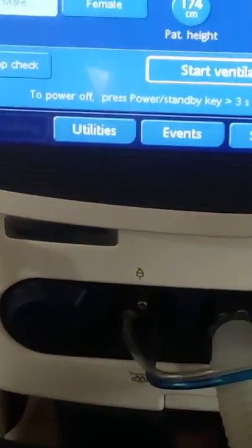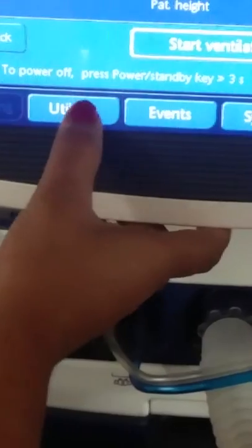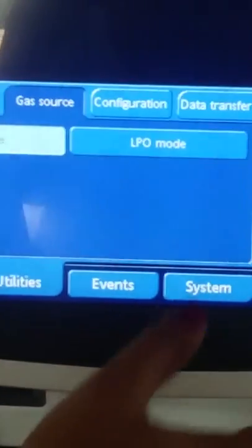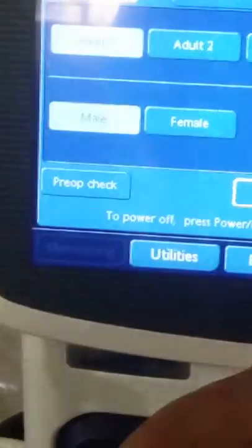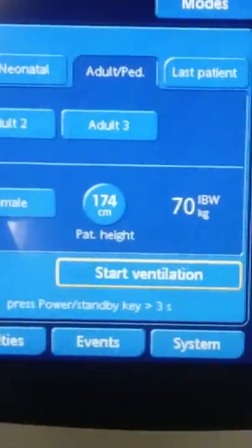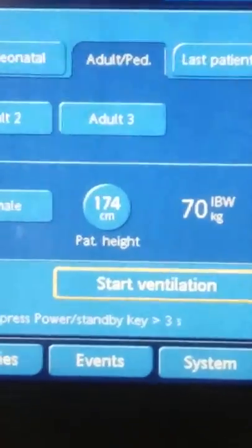Now touch Utilities, change to LPO mode, then dismiss the dialog box. Input the patient's height.